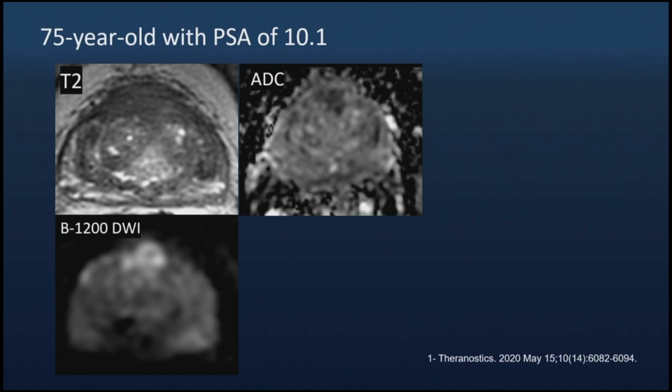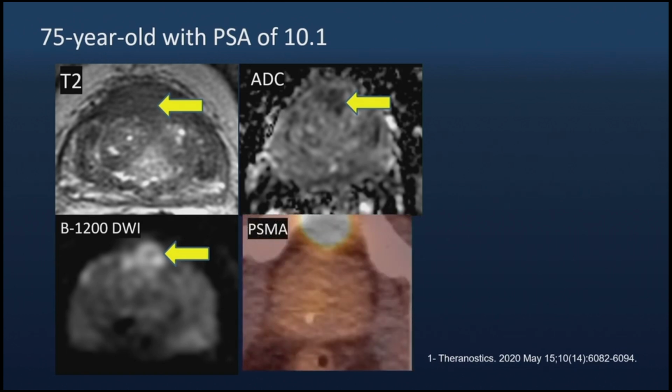So we got the MR on this patient first, shows a PI-RADS 4 lesion in the anterior fibromuscular stromal tumor. So yes, when we got the PSMA PET-MR, we're going to see an intensely avid tumor in the, wait a second. That uptake anteriorly is actually in the urinary bladder. We saw no uptake in the tumor. I walked over and reviewed it with one of my colleagues, just making sure that I wasn't going crazy, and he agreed, yes, that's clearly a tumor.